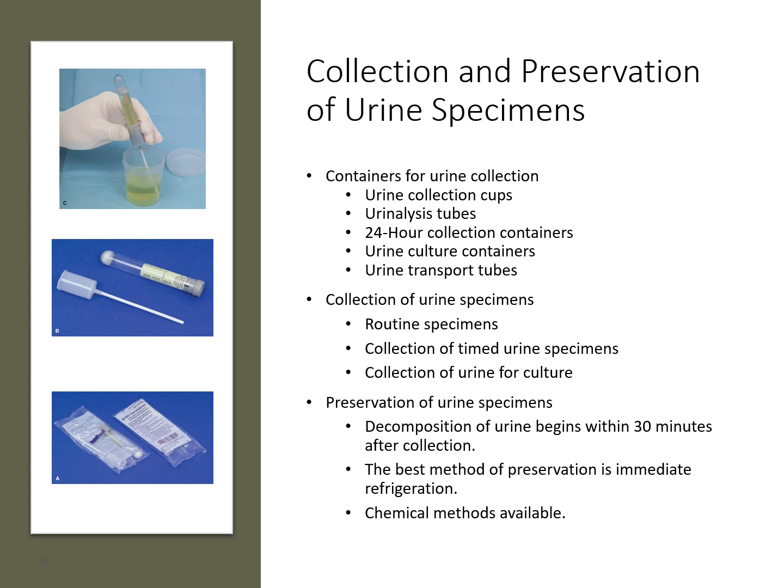And depending on what's going to be done with it, if it's just for routine urinalysis, or in this case would be for a culture. So this tube would help, number one, give a smaller sample, so you're not sending a cup that could potentially leak and have some sort of cross-contamination. And number two, it has a bit of a preservative in it to keep that bacteria from multiplying and replicating.